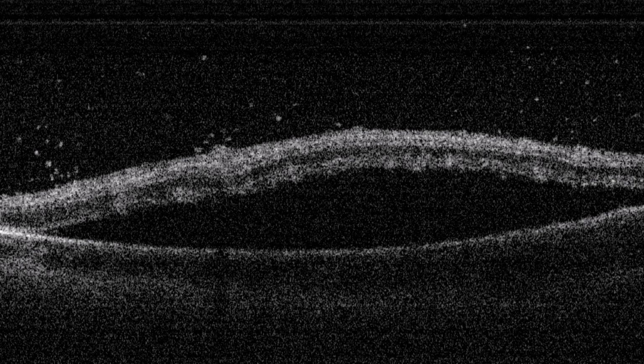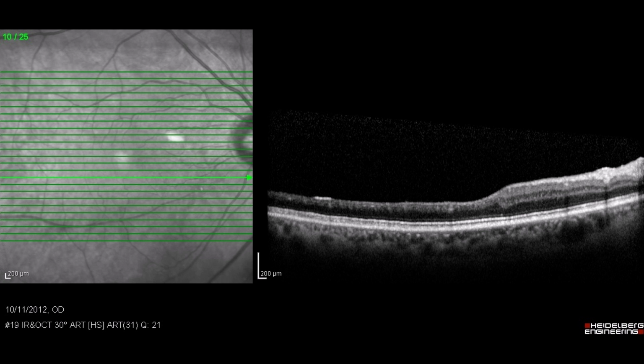This is a patient of mine with acute retinal necrosis. This is a peripheral exudative RD with vitritis overlying it. Patient ended up doing fine and going to a prestigious military undergraduate institution. So something missing in the inner retina.